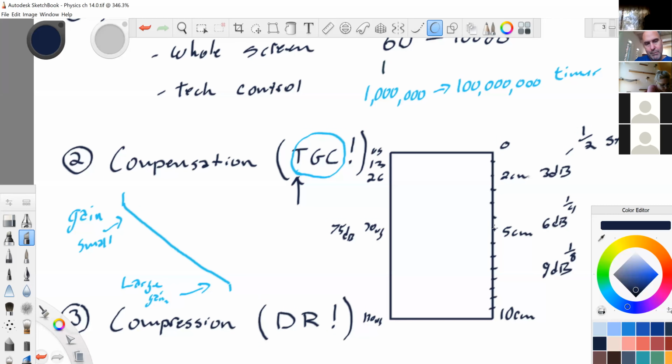So I'm going to move that toggle over, and I'm going to make this at 5 centimeters. I've moved my gain over. So at 5 centimeters, it's now going to gain it at, oh, I don't know, let's say we're going to cross out 75 and make it 85 decibels. Now I'm happy with my picture and we can move on.